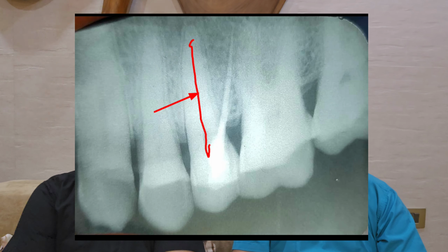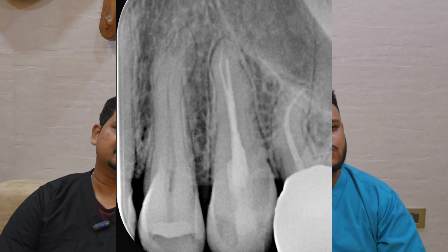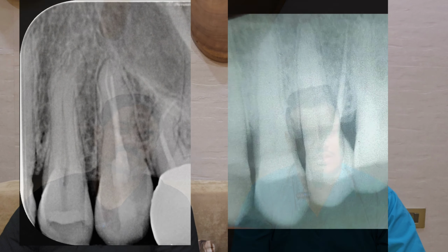This is a blunder and negligence on the part of the operator, where your root canal is somewhere and the material is going somewhere else entirely, maybe quacks are doing it, or I don't know who is doing this type of thing, but we see this very often in large quantities. Fortunately, the patient doesn't feel the symptoms till it gets very severe, and so they feel everything is okay. But it is not so. This ideal root canal should look like this, and in comparison we will show you how these are being done.